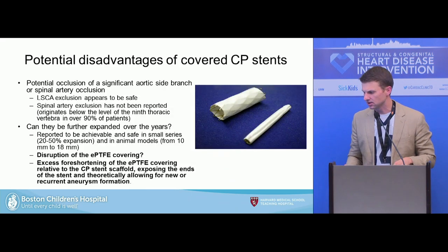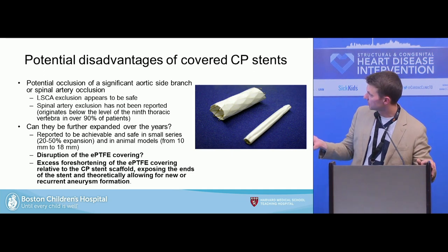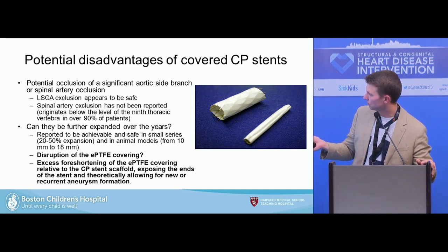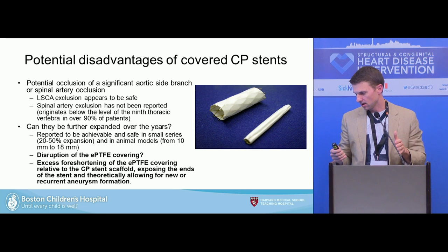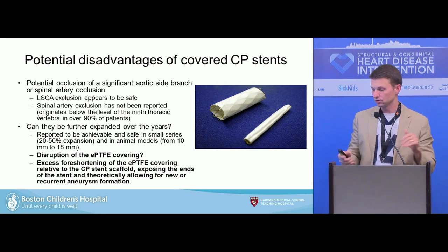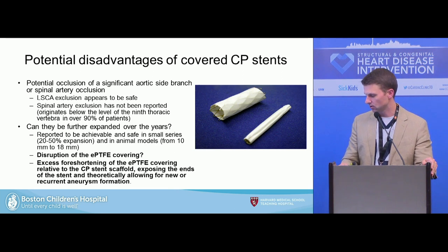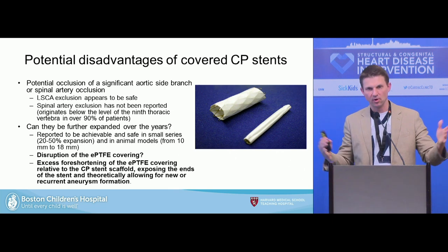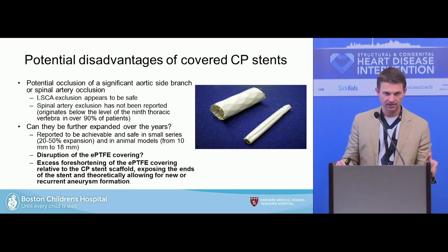Just a note on covered stents in general — this is not an iCAST Atrium stent, so the ePTFE doesn't wrap around the hardware all the way to the ends. You have to know at what point the covering stops relative to the distal stent — you can't see this on fluoro. When placing them in small kids and re-dilating, you have to consider whether there could be any foreshortening of the ePTFE covering and which areas of the aortic wall are vulnerable as you're deploying these stents.